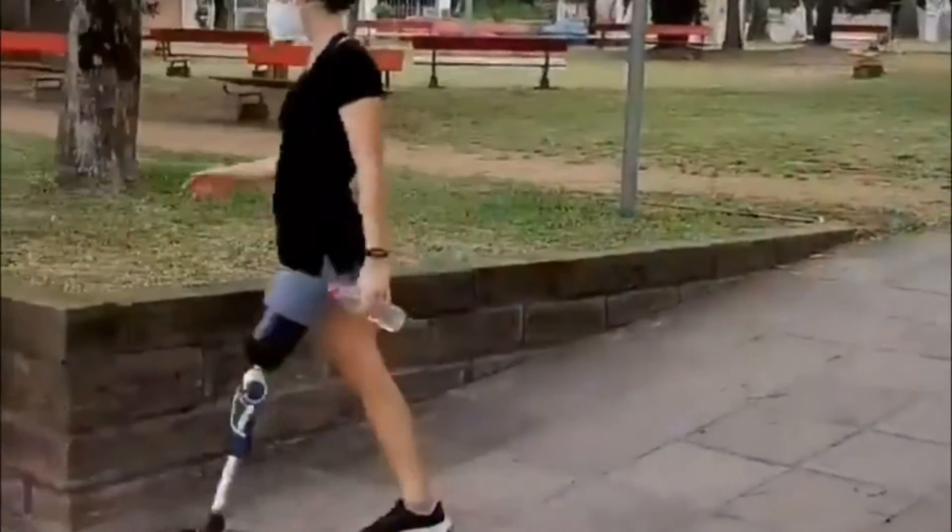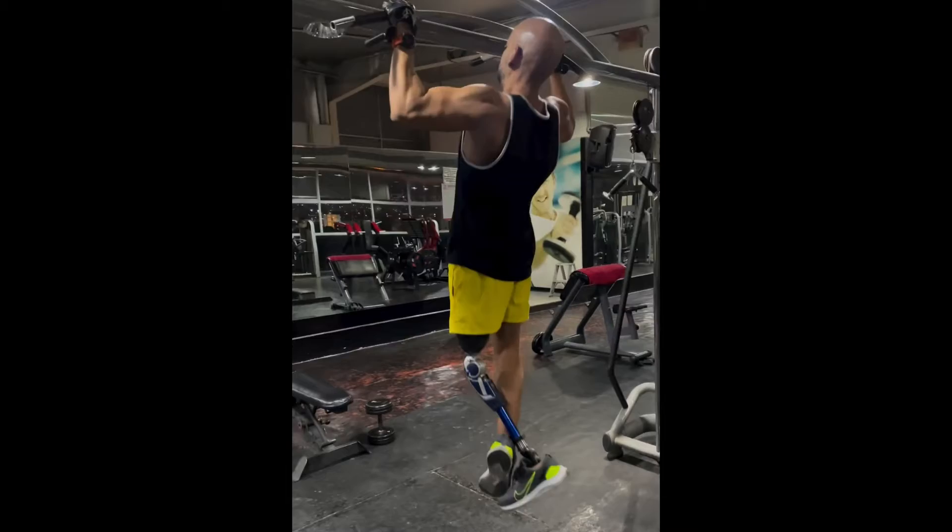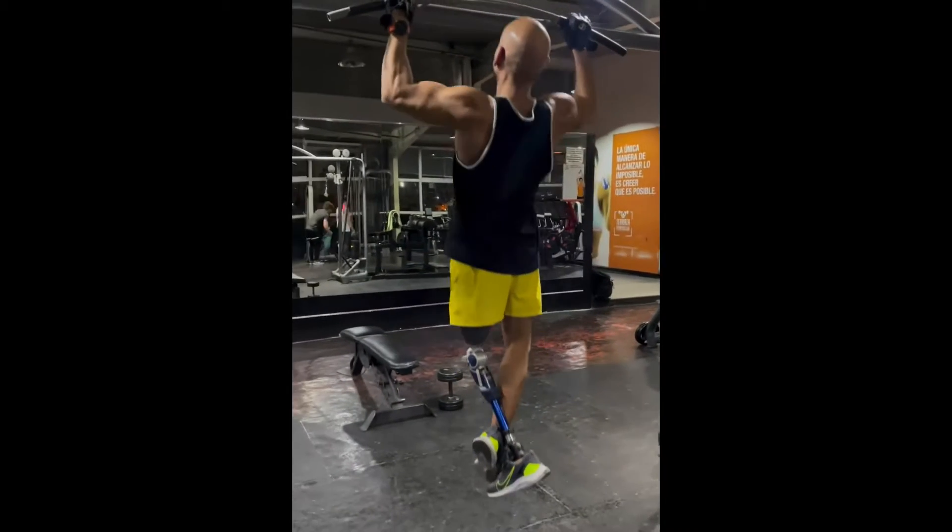In dynamic trial fitting, the patient must be given sufficient time to become familiar with the functions of the prosthesis, thereby learning safe use for everyday life.